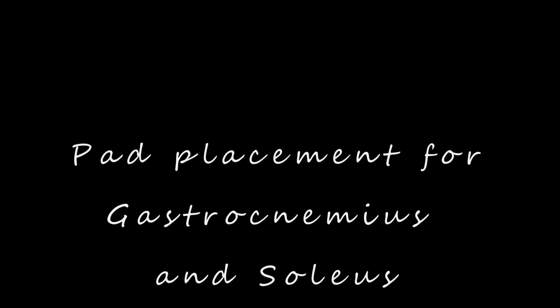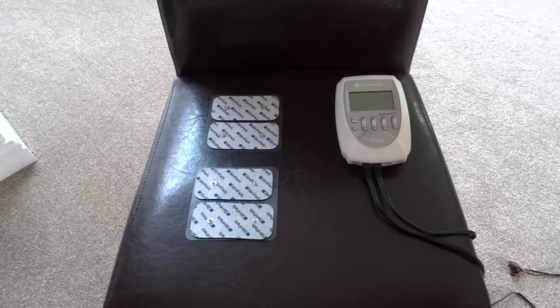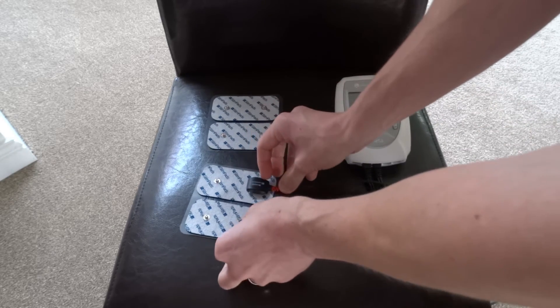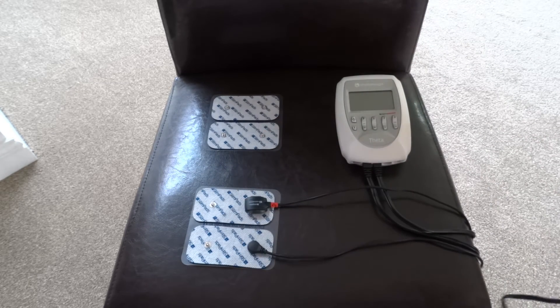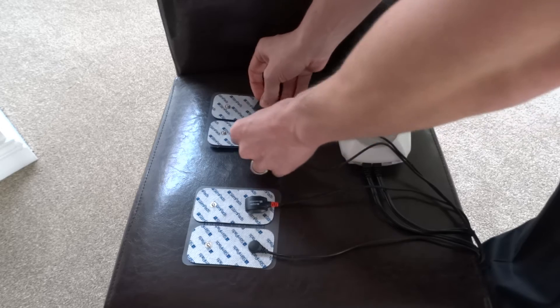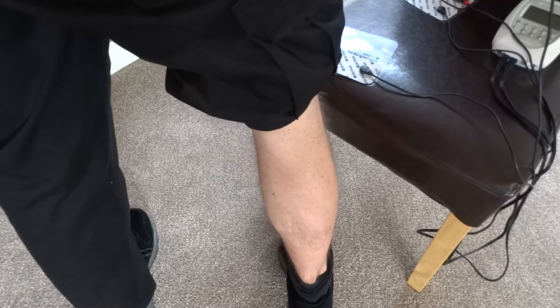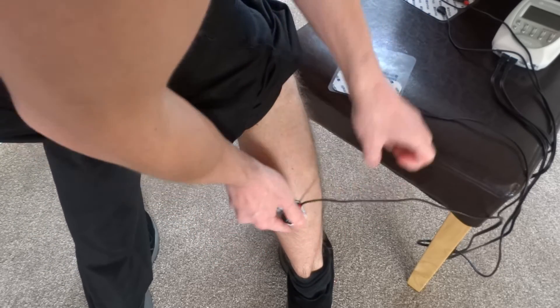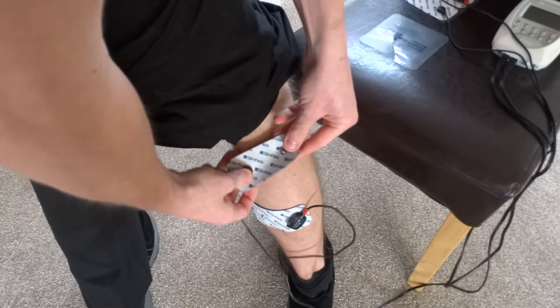Where do you place the pads for stimulating the Gastrocnemius and Soleus? The pad placement will be the same for each — you will get both. You need two 5x10cm electrode pads for each calf. Place the negative black electrode on the proximal upper calf, and the positive red electrode on the middle of the gastrocnemius muscle bellies. This way the current runs through the motor points of both the gastrocnemius and the soleus.